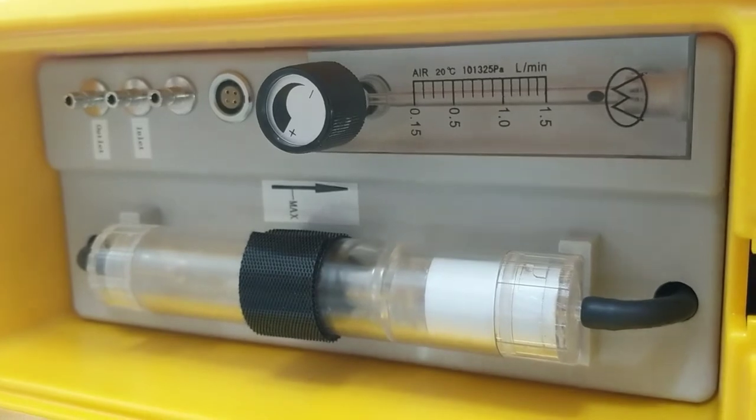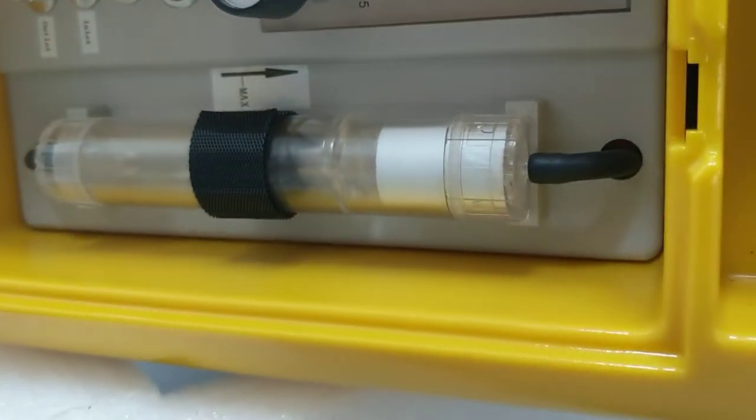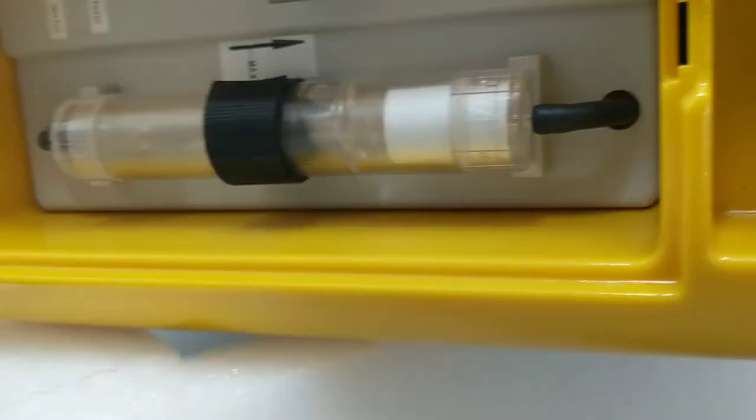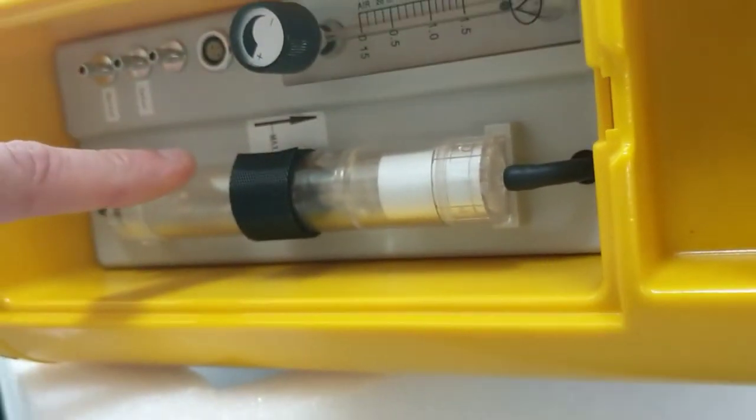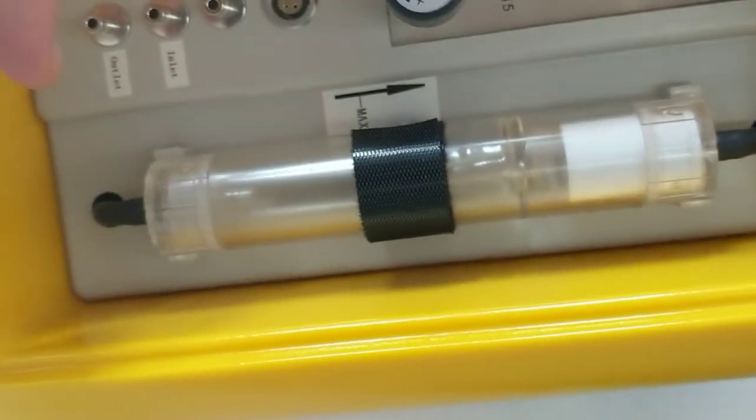Liters per minute, that looks like our rotameter. Maybe a filter over here on the side. I don't know what that's for.